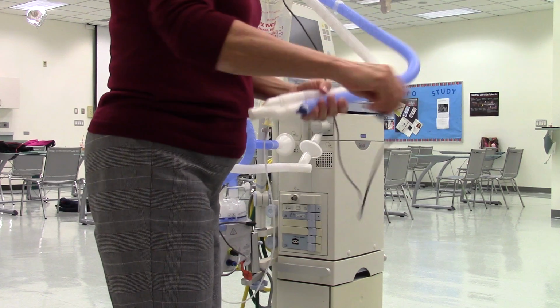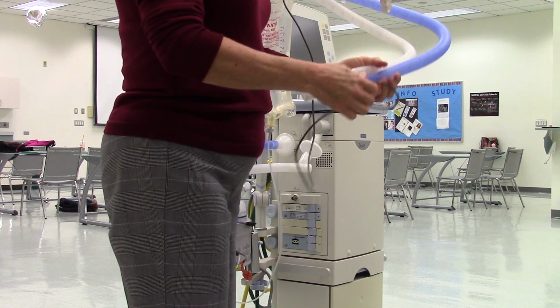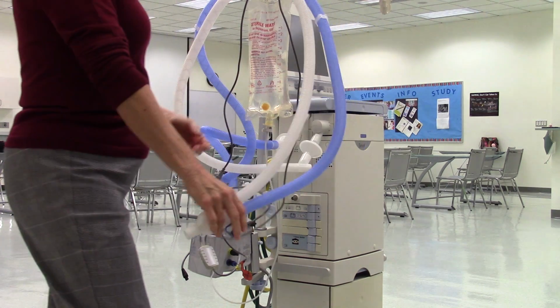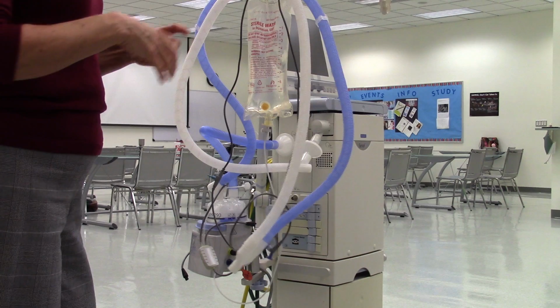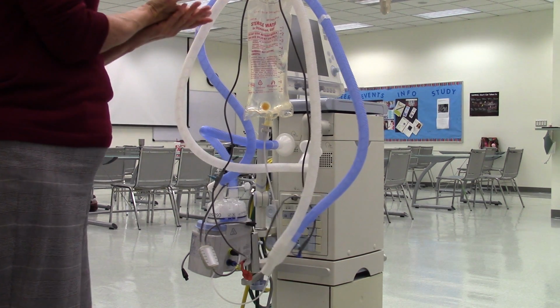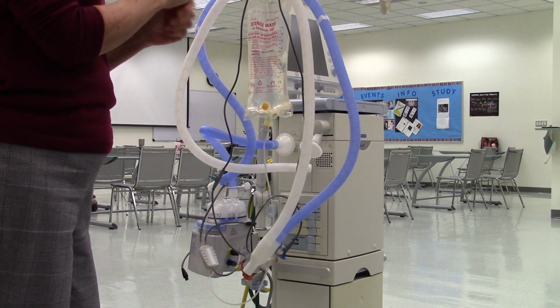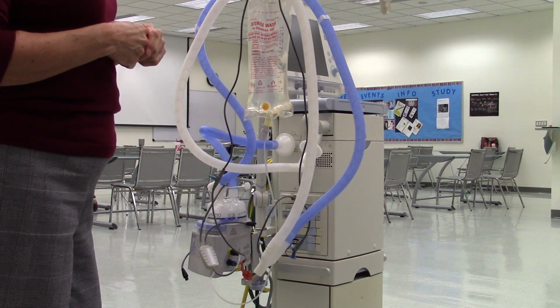Why is it important to know the temperature? Because we're using the humidifier that heats the water? Yeah, good question. So the humidifier has to know how hot to make the water vapor. And if it senses a cool temperature, then it'll turn on that heating element and warm up the water some more. Gotcha. So it can reach all the way over here? Yes. Got it, okay.